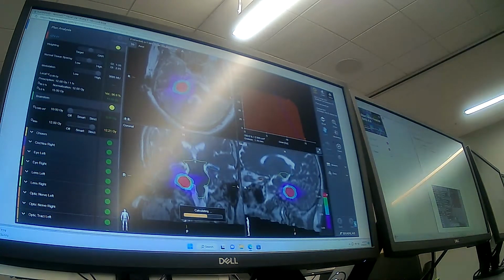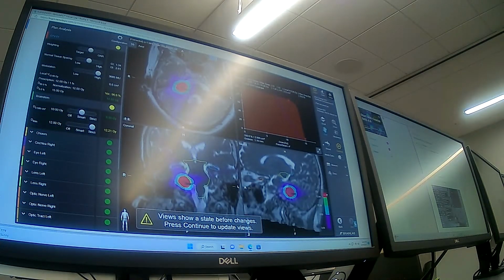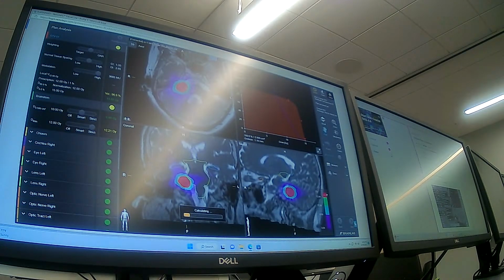So you see what it did with the brainstem? We got to there, yeah. I'll be able to get a better plan with you. Yeah, I'd do 4, like you said. Battery running down.